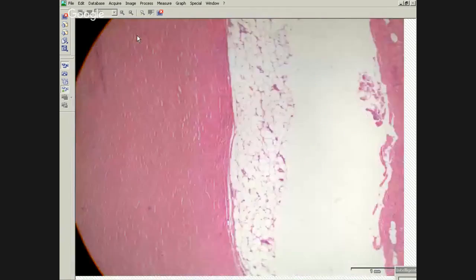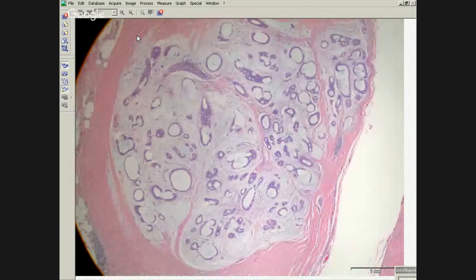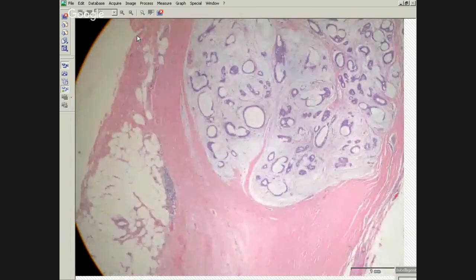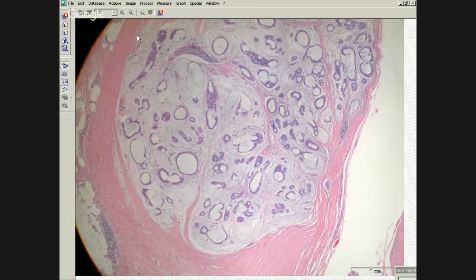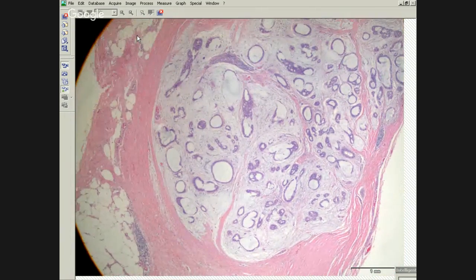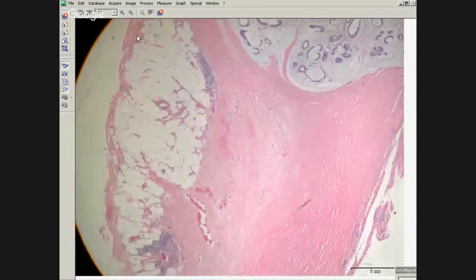So Dr. Beasley, we do not at least think of mesothelial proliferation in a case like this, right? Well, this is not benign because it's invasive. So you've got infiltrating glands going from one side of the pleura to the other. And they're too close together. They're infiltrating in different ways. So this is an invasive mesothelial process.